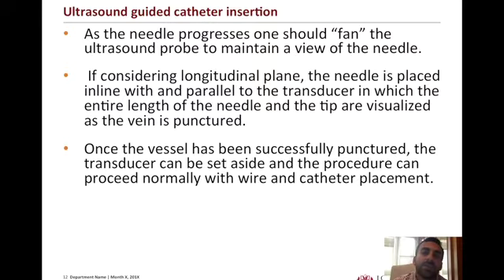Alternatively, you could do a longitudinal plane approach in which you could visualize the needle shaft throughout the procedure as well.